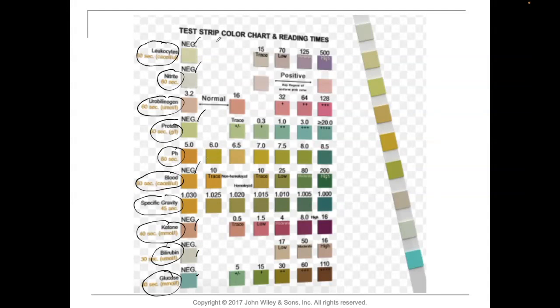Once we start to move in this direction, now it's kind of like trace, like slight evidence of it means trace, or there's a low amount or a high amount, right? The more we move to the right, the more serious the condition, obviously.